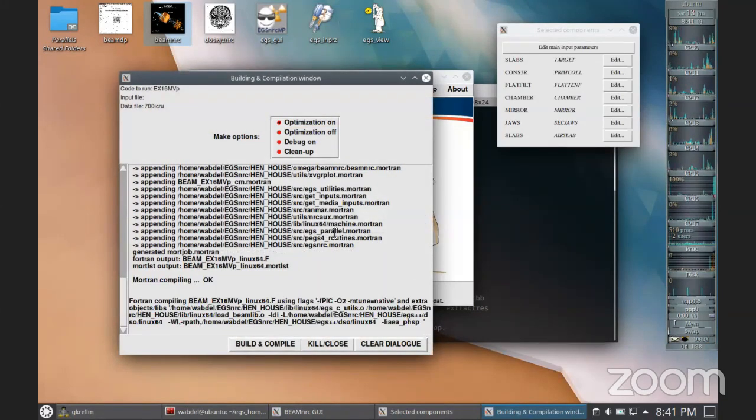What I want to show you is that the dosxyz file actually uses a phase space file as an input in the calculation. So we need to just generate the phase space file.